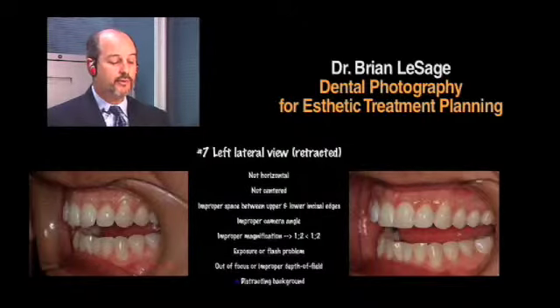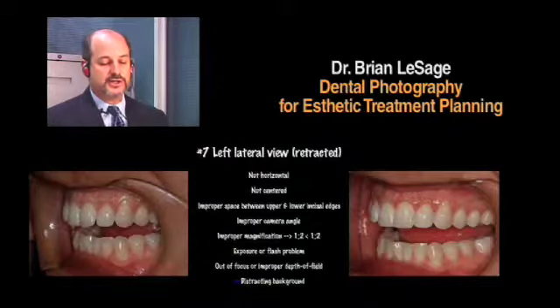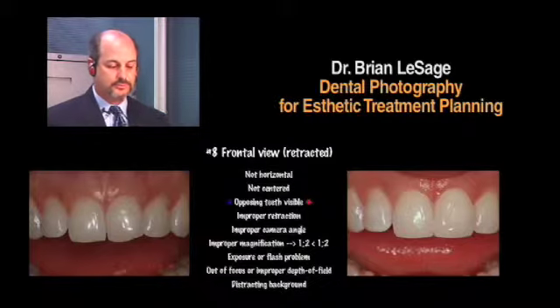Probably more important than that, as far as I'm concerned, is I'd like to see a little more retraction. So I usually tell them, release this one a little bit. Don't take it out of their mouth, but let go of it a little bit. Let's pull a little harder to this side. And you can see, now we're back to the first molar in the after view. So that's good retraction there. This is a better view than this one over here on the left, all right?